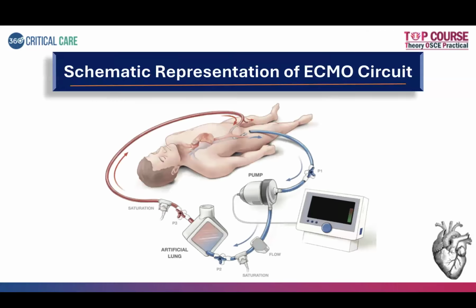So this is the schematic representation of the ECMO circuit. I think most of you are aware of it. You would have seen this very frequently. There is always a drainage cannula and a return cannula. The drainage cannula passes through an ECMO pump, which acts like the heart.